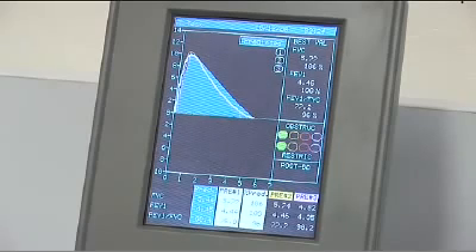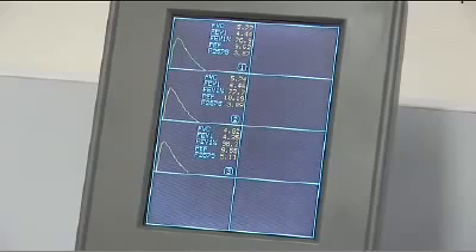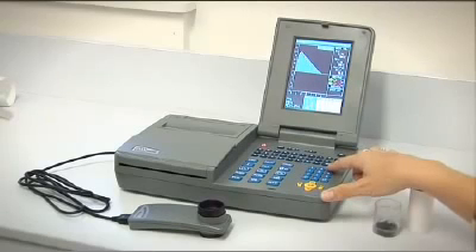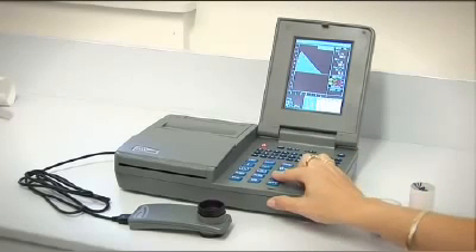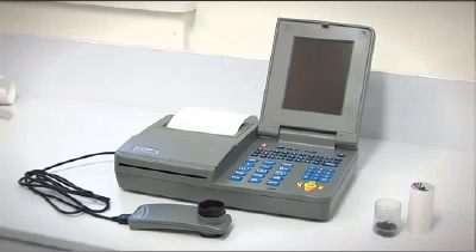Pulse oximetry is offered as an optional additional module for your SpiroLab 3. Internationally, the Italian manufactured MIR SpiroLab 3 has become the spirometer of choice amongst health professionals, and it is easy to see why.